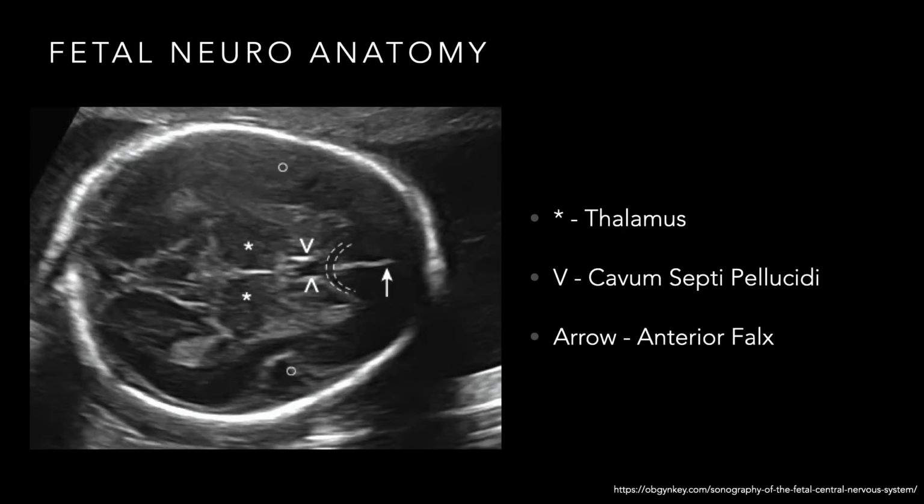So this is the axial transverse view of the fetal calvarium, essentially, sometime during the course of pregnancy. Obviously, it's a little bit further developed than first trimester, but this is kind of what you're going to see. And this is the level we want to look for, right?